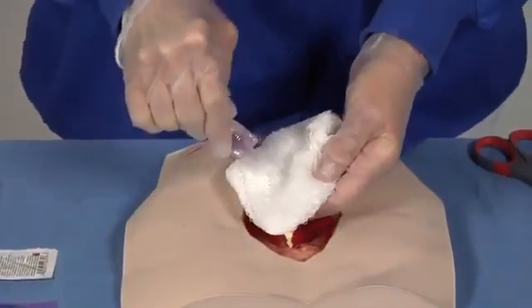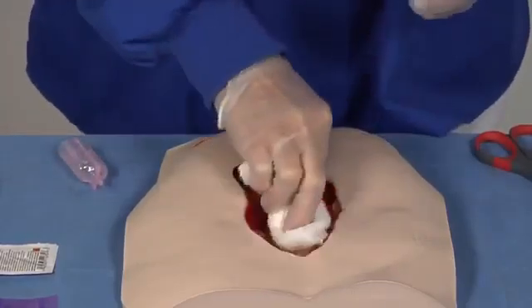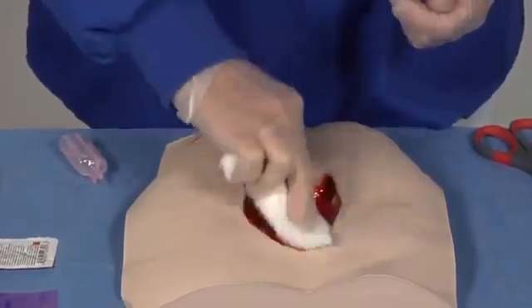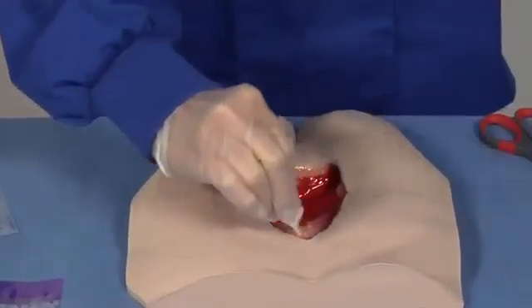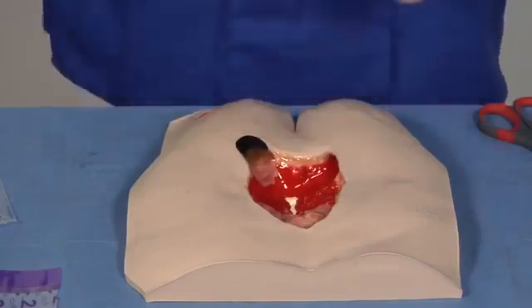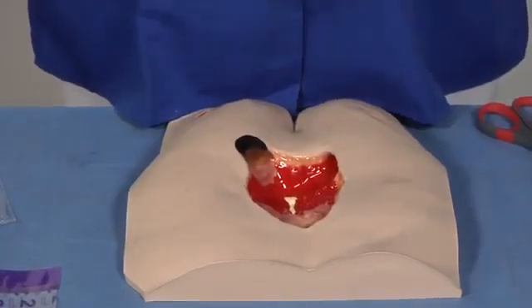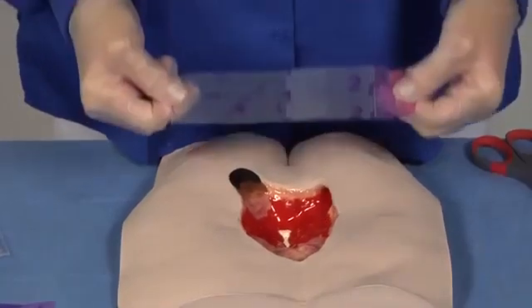First, cleanse the wound with normal saline or per facility protocol. Second, apply skin prep to the peri-wound area and let dry. As an option, transparent film may be applied to protect the peri-wound area using a window pane method.